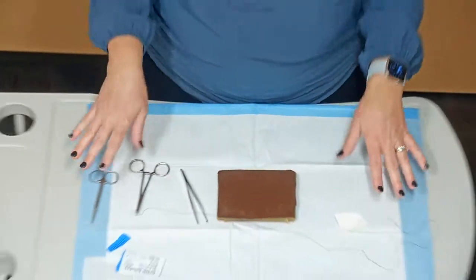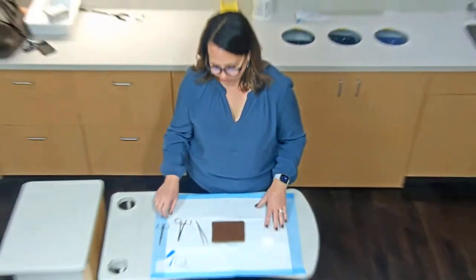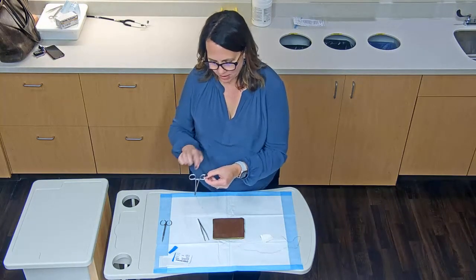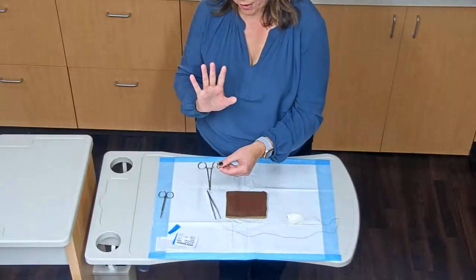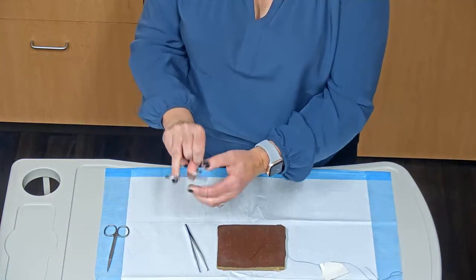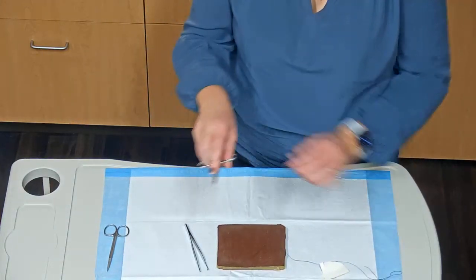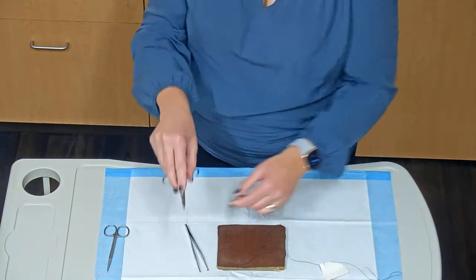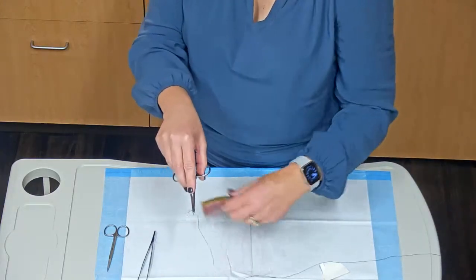As with any procedure, one of the most important things is proper technique. So I wanted to take a minute just to review the thenar grasp. When we hold our hemostats with the suture and needle ready and loaded, we will use our thumb and third finger. When you use this, you don't want to go beyond that first knuckle, and you'll use your index finger to guide. If you go in really far, you're going to end up doing this kind of move. So just lightly hold, and you'll have your rainbow off to the right.